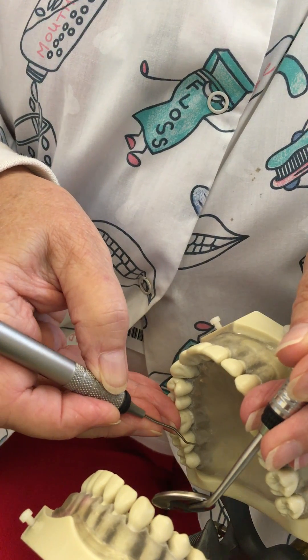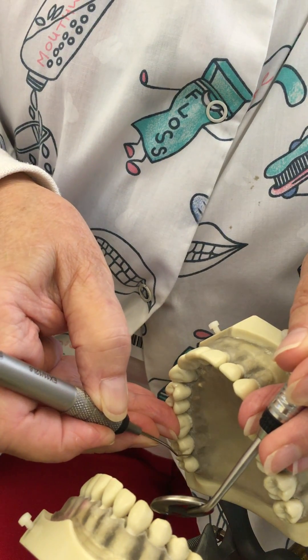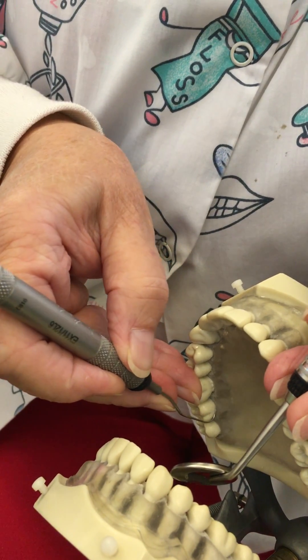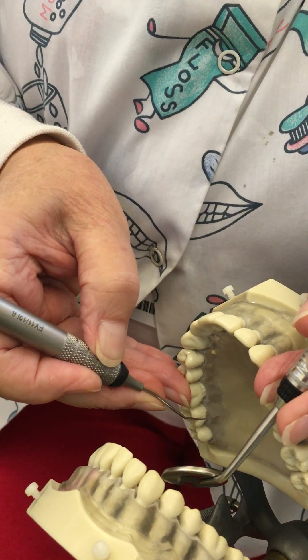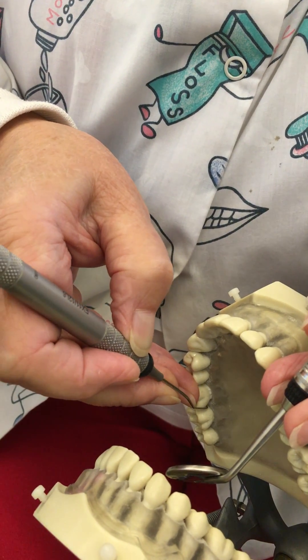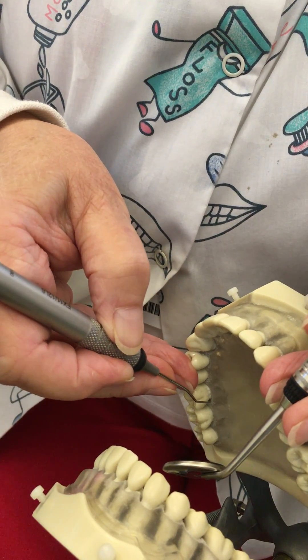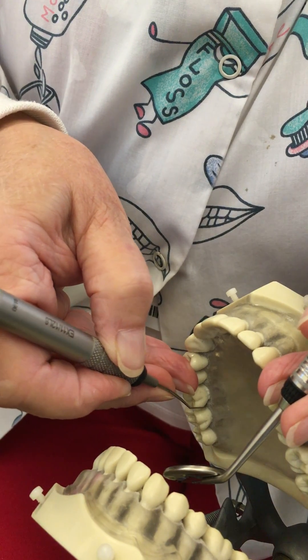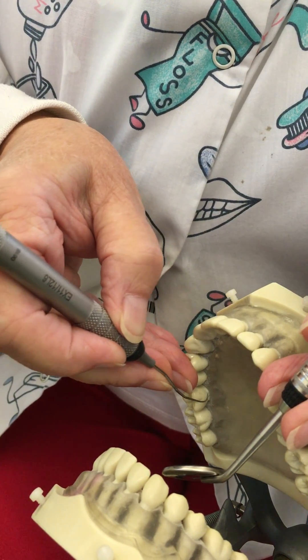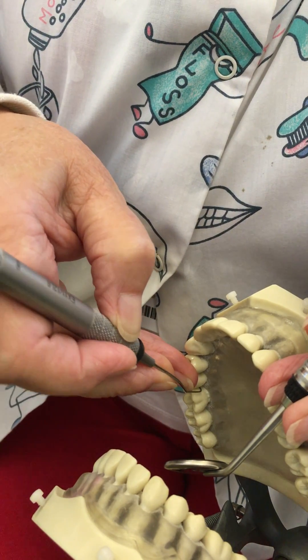Then I'm going to shorten up my instrument slightly, start at the distal line angle of the next tooth — I'm piggybacked and rolled over my fulcrum. Shorten up my instrument some more because I'm getting more anterior. Right now we are exploring at the cervical third of each tooth; you can go subgingival if you want to.